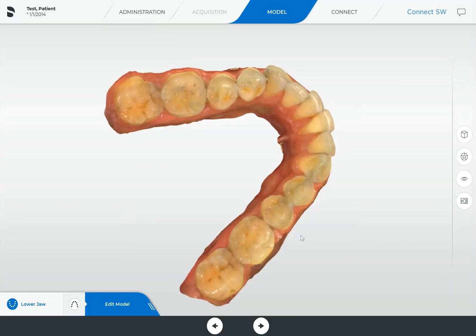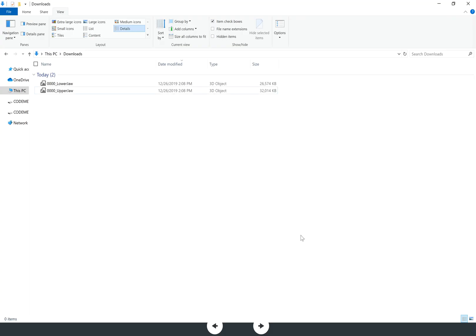You can see it's very fast, the software already finished, so we'll go over to our download folder and you can see we have the upper jaw and the lower jaw in here.